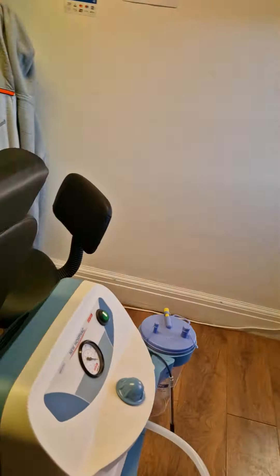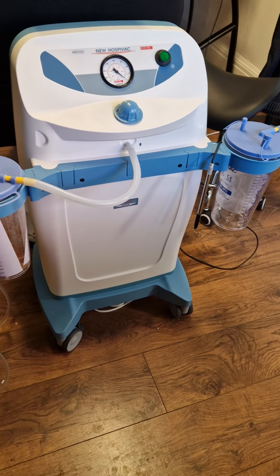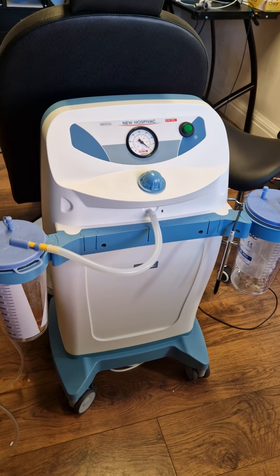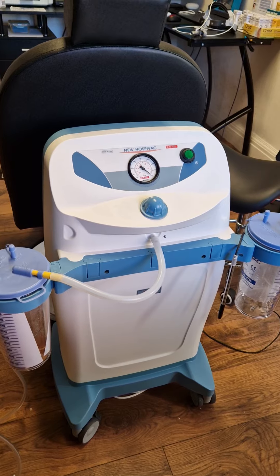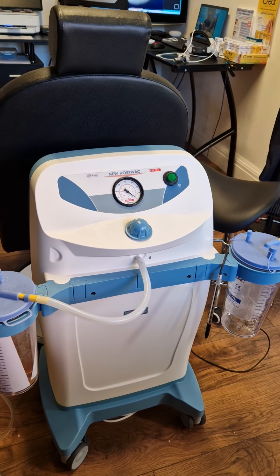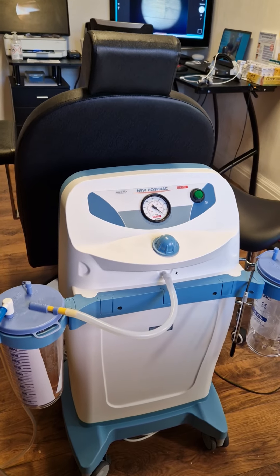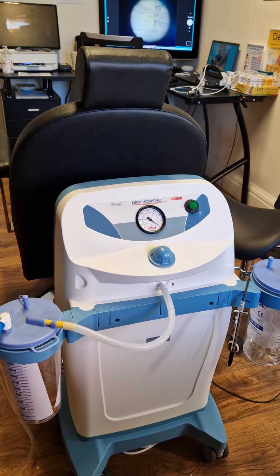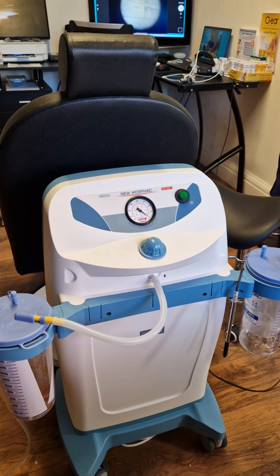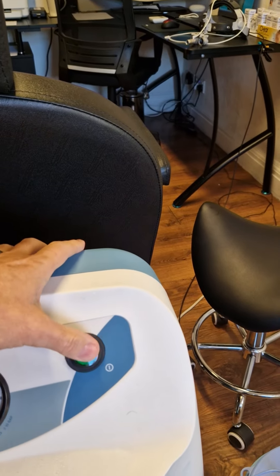This is the suction machine — this is called a Hospivac. You might not know this, but they're actually all used off-label, meaning they're not specifically designed for earwax removal. There isn't one that exists specifically for that purpose, so they use machines designed for other things — like aspirating body fluids during surgery or liposuction. Technically it's used off-label, which we explain to all patients.